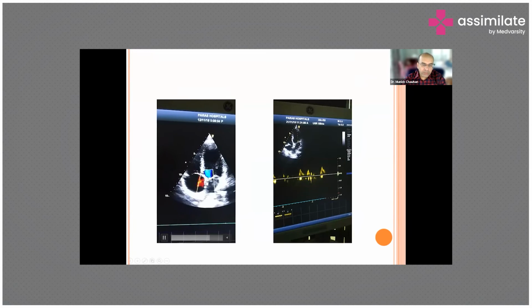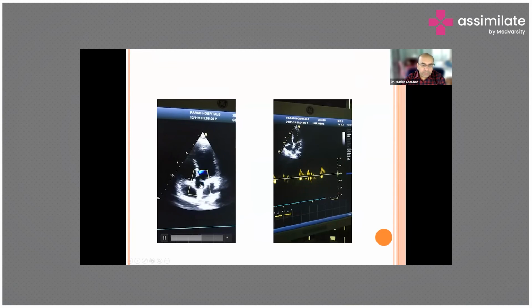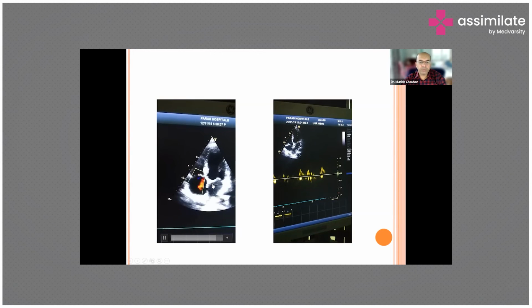We will get an aortic outlet here. This is the aorta, the LV draining into the aortic outlet. So we call that a 5-chamber view also, the 5th chamber being the aortic.